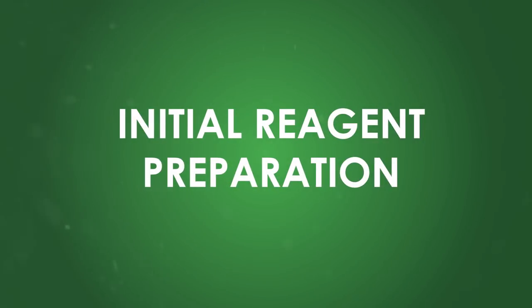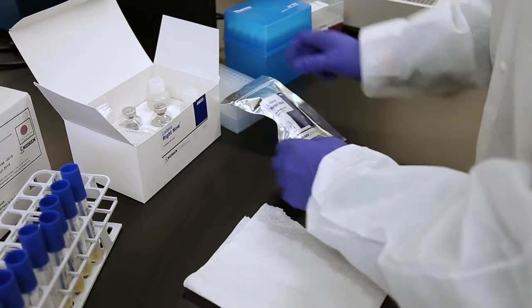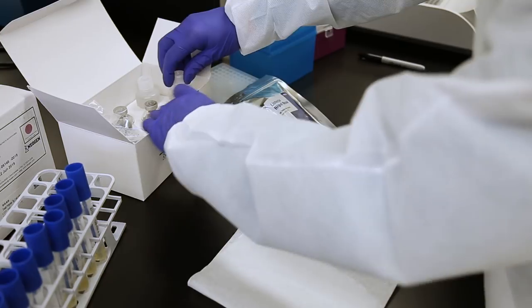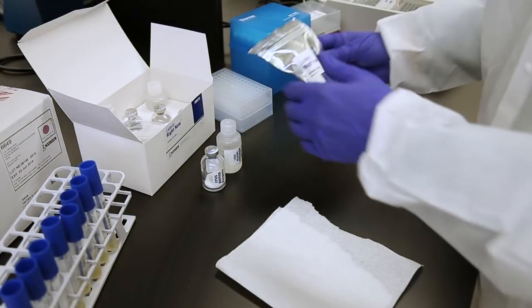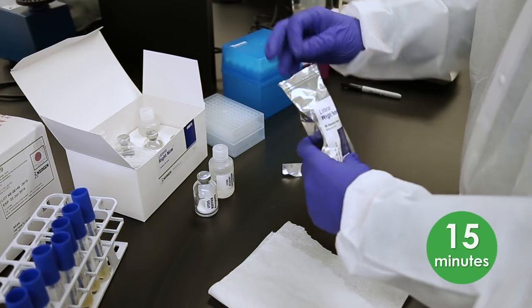Initial Reagent Preparation. Prior to running the kit, the lyophilized lysis reagent, lysis reagent suspension buffer, and appropriate number of reaction tubes for the number of samples you're running need to rest at room temperature for at least 15 minutes.